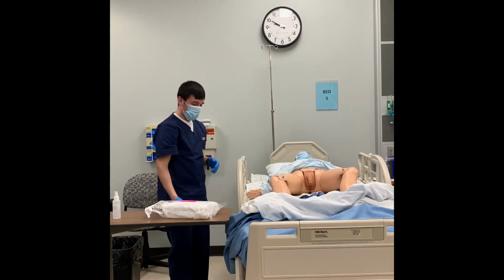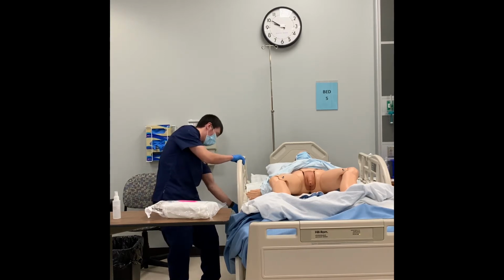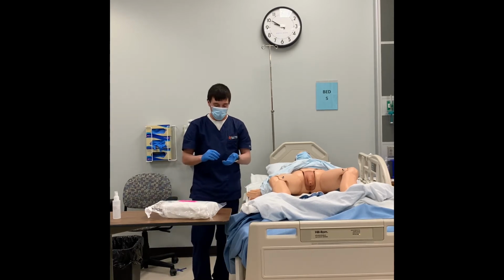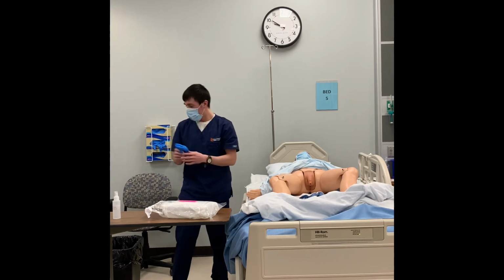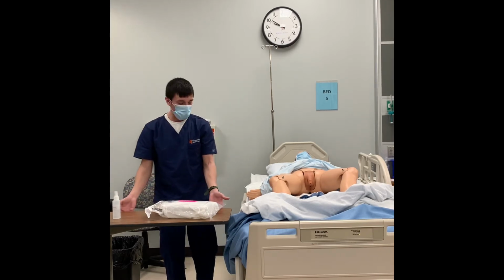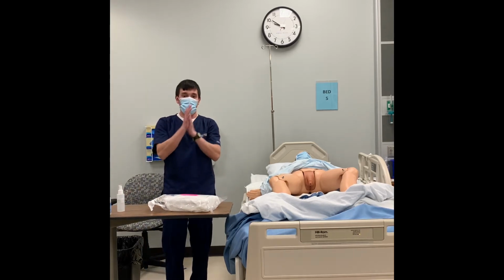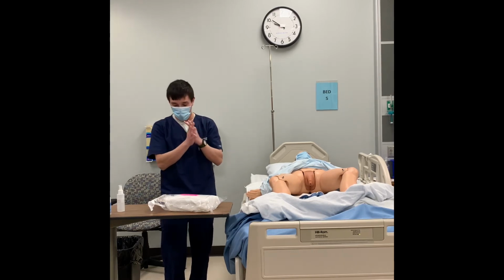Okay, so from there, I would go ahead and take down the bed rail, making sure that I no longer leave the patient's side. Okay, now I'm going to take my gloves off and discard my gloves. And now I have my catheter kit, and I'm going to perform hand hygiene before I get into the kit. When I do my hand hygiene, if I'm using sanitizer, I want to make sure that I rub thoroughly so that the hand sanitizer is dry.